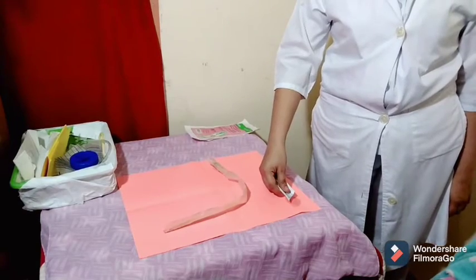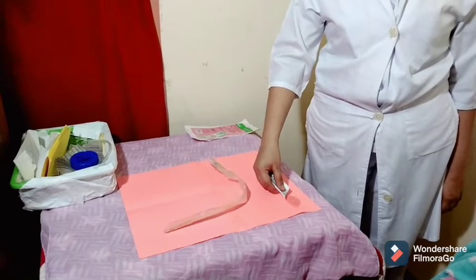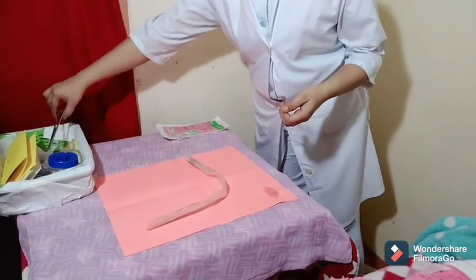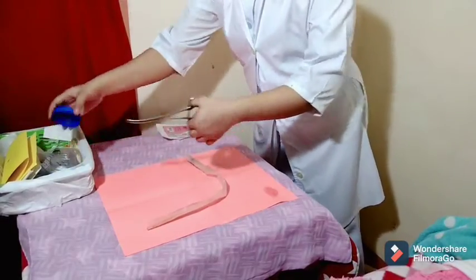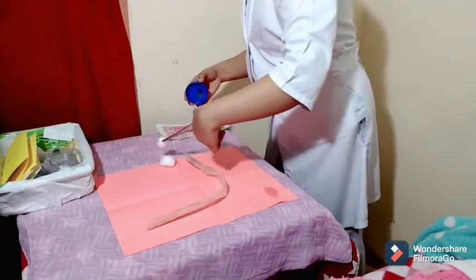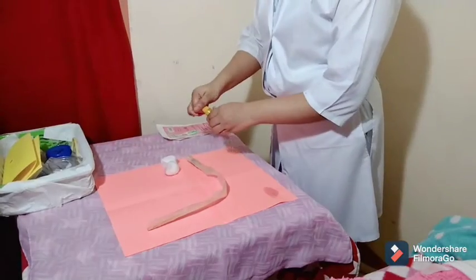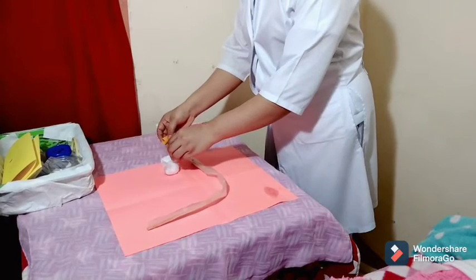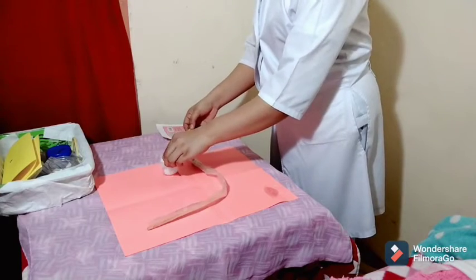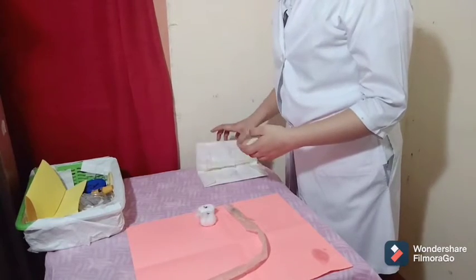Squeeze an amount of lubricant over the sterile field. Organization promotes efficient time management. Get 2 cotton balls from the pack and place them on the sterile field. Pour betadine over them. Put on sterile gloves to avoid cross-contamination of microorganisms.